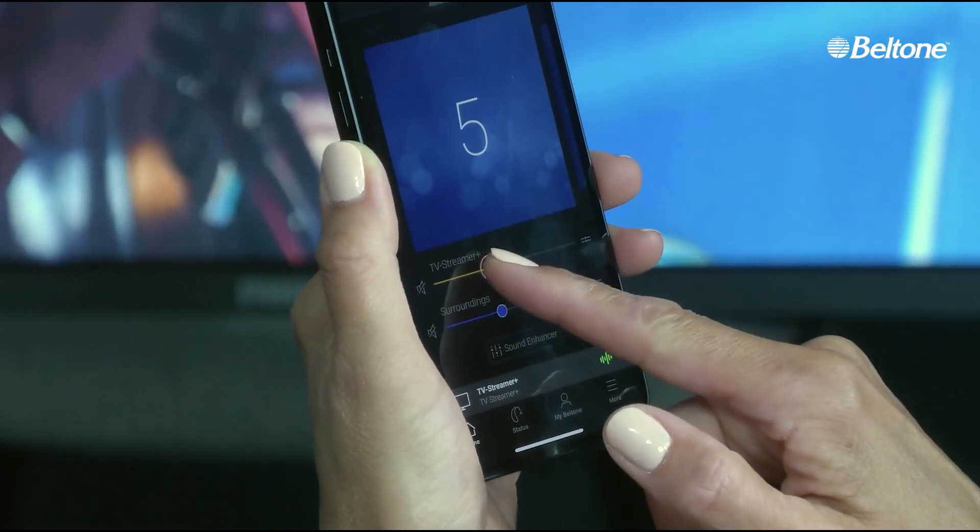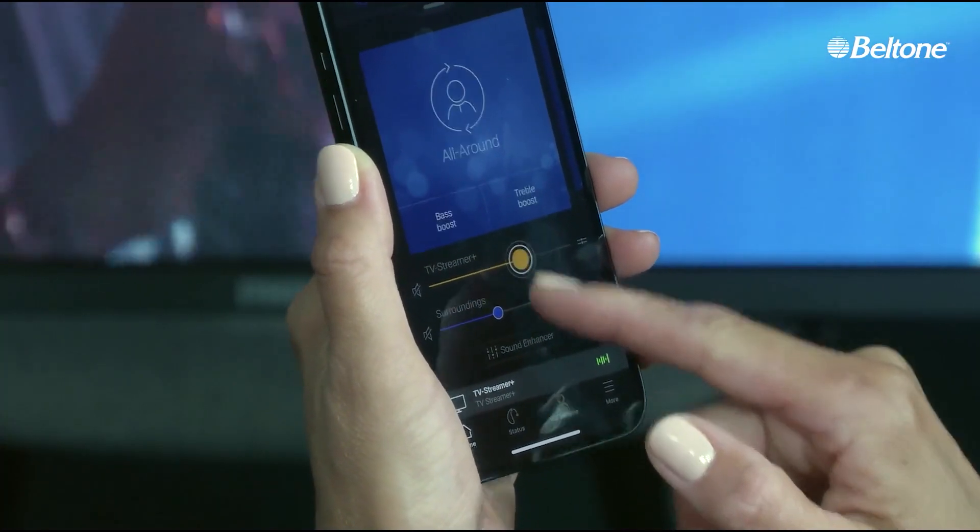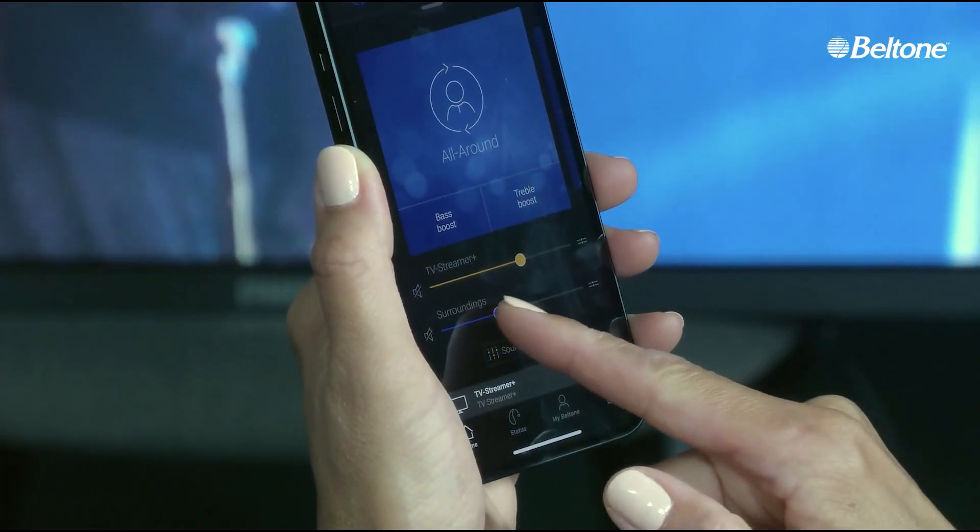There is a close-up of the phone showing the HearMax app. Her right finger touches a small yellow dot noted as TV Streamer Plus and glides the dot across a line going to the right. This increases the number on her phone screen from 5 to 6 to 7 to 8.